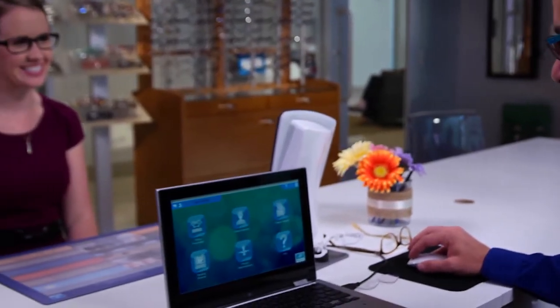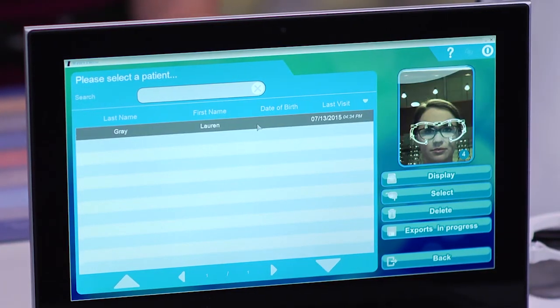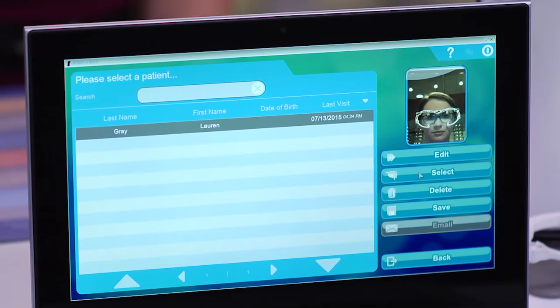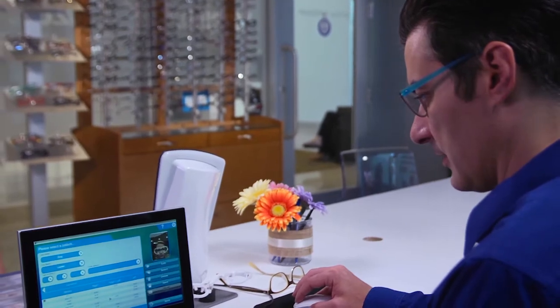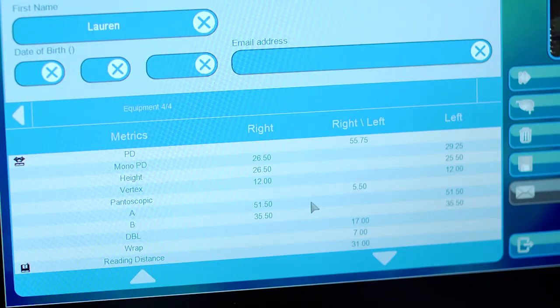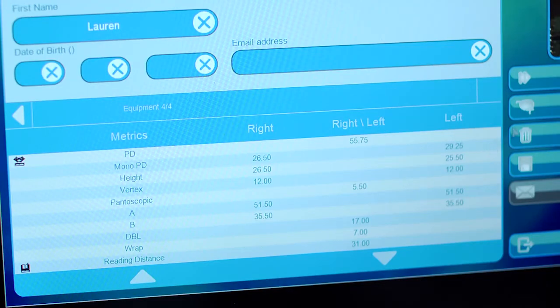Once you've completed the measurements, review the results by selecting the patient records icon on the home page, then the patient's name and the display icon. The measurements displayed include the pupillary distance, half PD in near and far vision, height, lens eye distance, pantoscopic tilt, and the various boxing measurements. The frame measurements displayed include the A, B, and DBL dimensions and the curve angle measurement. Once these measurements have been taken, it's important to check the results and confirm the values are consistent. You can send the patient's record via email or click on the circle icon in the upper right corner to return to the home page.